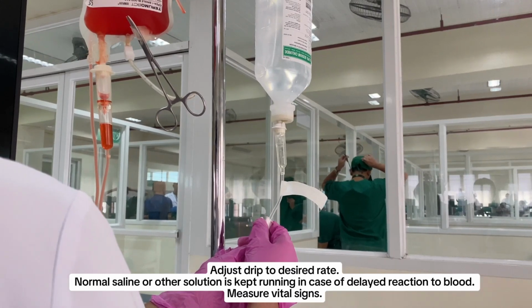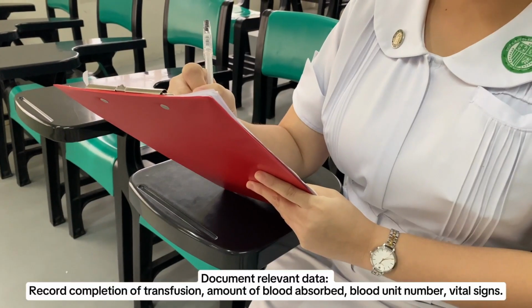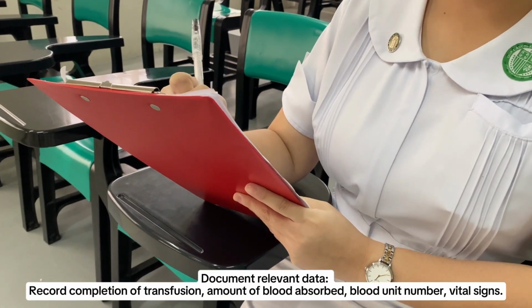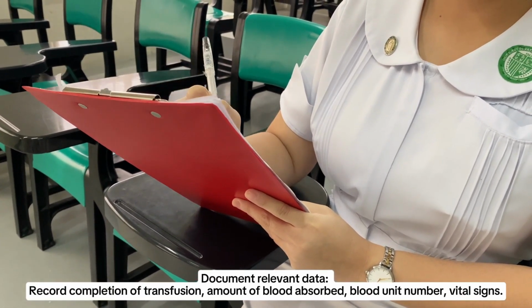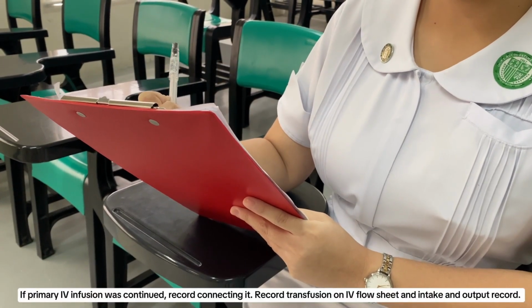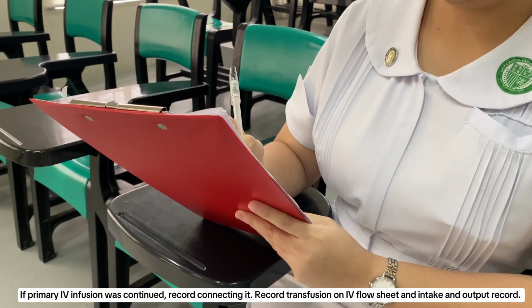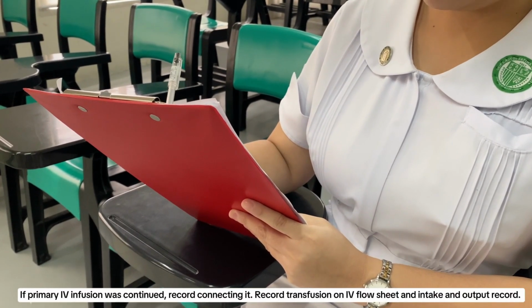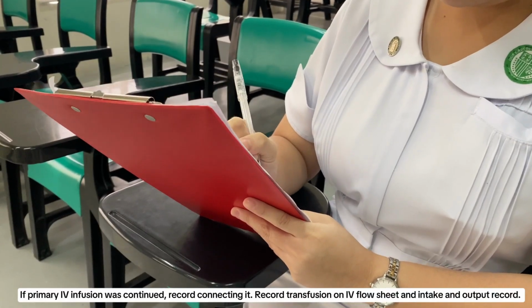Then, measure vital signs. Document relevant data. Record completion of transfusion, amount of blood absorbed, blood unit number, vital signs. If primary IV infusion was continued, record connecting it. Record transfusion on IV flow sheet and intake and output record.